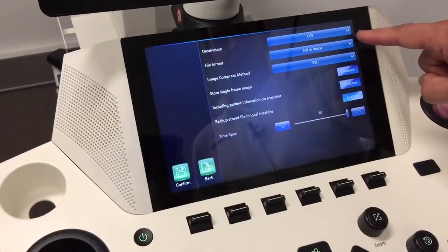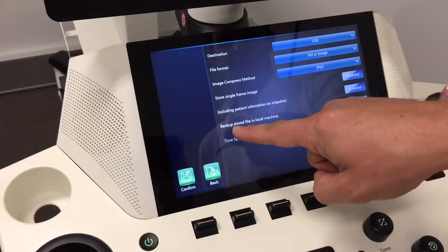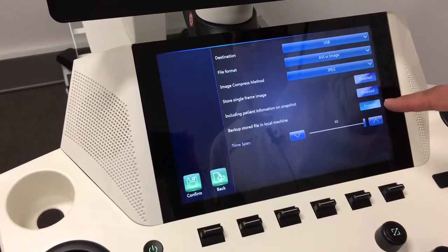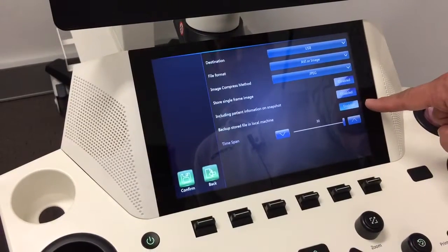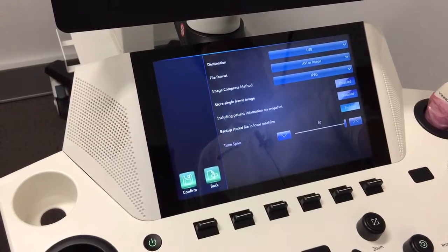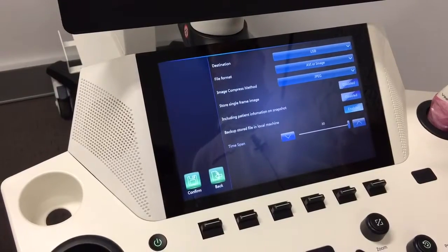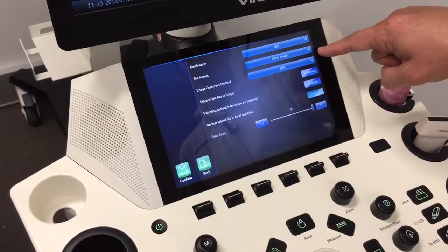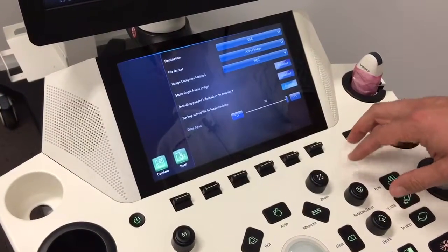For USB storage, you also have the option, which is slightly different to the last screen, of being able to back up that stored file in the local Vino machine. When that's enabled, even when you're storing it straight to the USB, you're also going to end up with a copy on your Vino machine. So you don't have to double up in terms of saving it to your USB and then going back and saving it onto your Vino. It'll both happen at the exact same time, and it will be stored in this file format. So quite a useful feature if you want to quickly save it to USB and also have a copy saved in your machine.